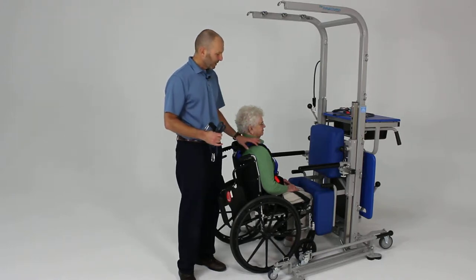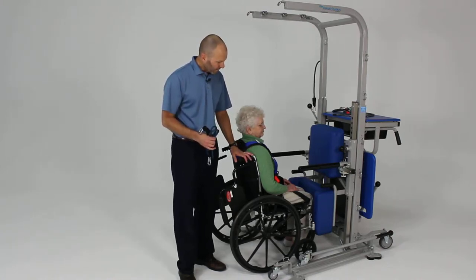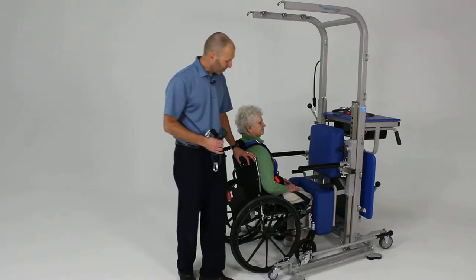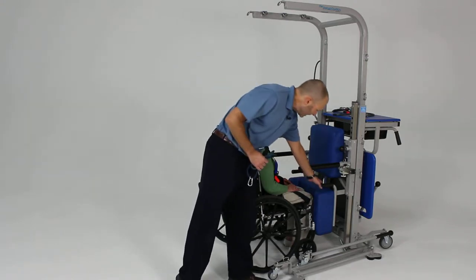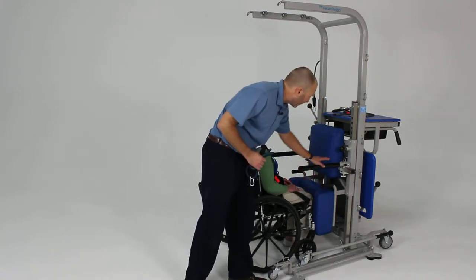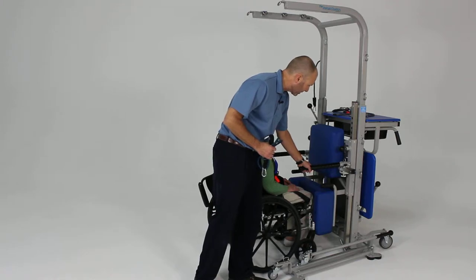For a patient who's having difficulty with basic sit-to-standing ability and standing tolerance, we can set them up in a nice environment conducive to safe sit-to-stands and transfers. We have the patient pulled up in their wheelchair, the optional knee pad added to the unit to provide a block for the knees, and the arm supports in the down position so they have something to help pull up with or use for support and stability.